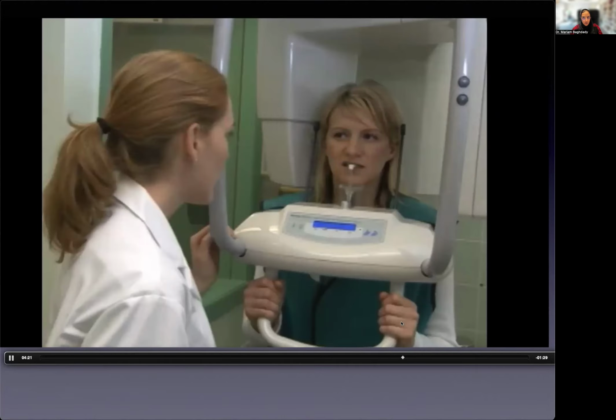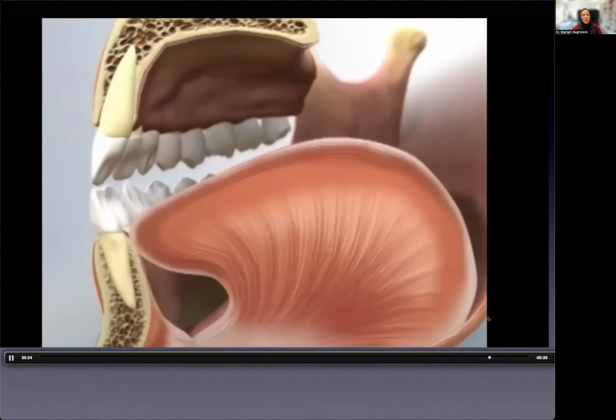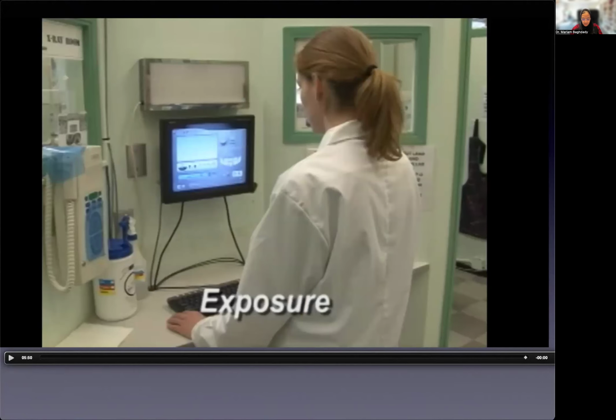And we're going to make sure that the anterior and posterior positioning of the patient is correct. And we're going to do this interactively in a second. And then we're going to give the patients the proper instructions to keep their tongue flat on the roof of their mouth so that we don't get any air in the oral cavity or in the oral orifice. Okay?